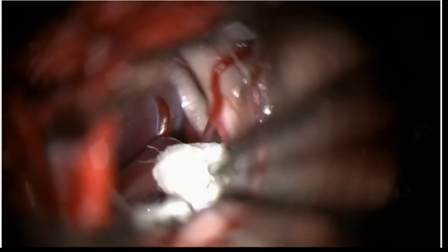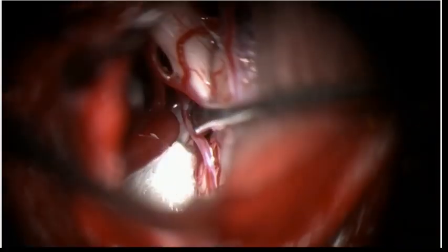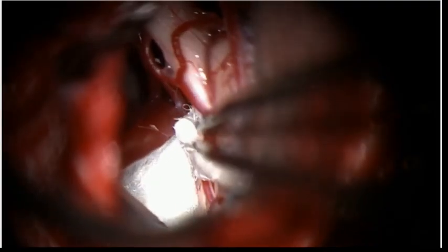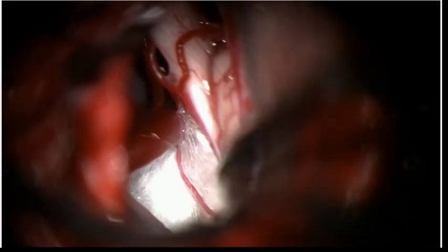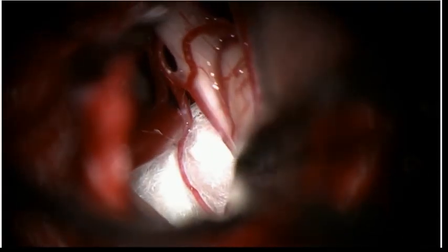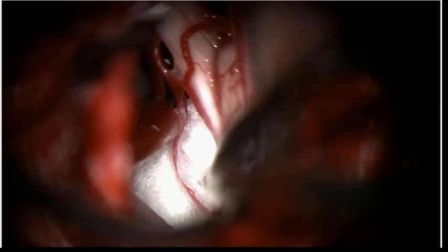After identification of the vessels responsible for the compression and adequate mobilization by arachnoid dissection, a small piece of hand-rolled shredded Teflon is carefully placed to permanently block the contact between the vessel and the affected nerve. Multiple pieces of shredded Teflon may be used to release complex compressions. Teflon is a suitable material for decompression because there is close to no reactive fibrosis. This is particularly important in cases of revision, where the Teflon placed years ago can still be removed completely.